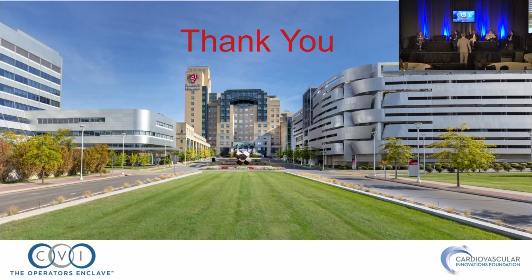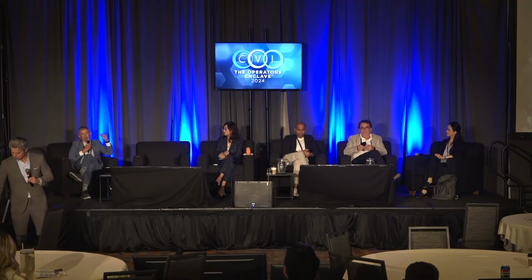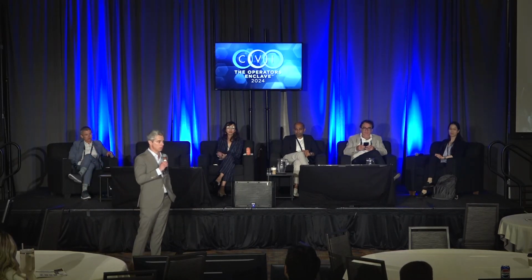Well, another trick is we just use the back end of a J wire, the stiff end, and then you just have the wire sticking out, and you put that in, and then the pigtail goes in, and then you remove that. Yeah, the key is to be attentive to that. I know of 2 mortalities across the United States where a large bolus of air was entrained and went up to the cerebral vasculature, and the patient coded and died.